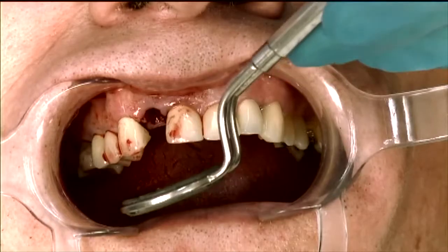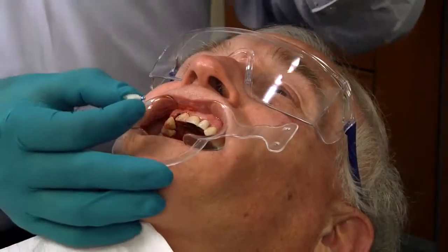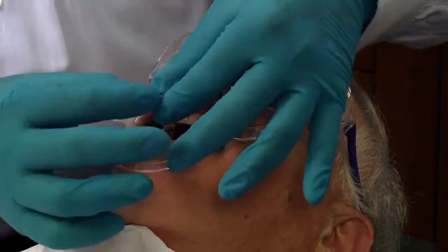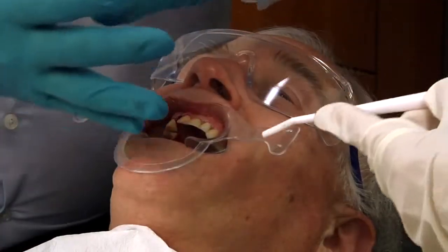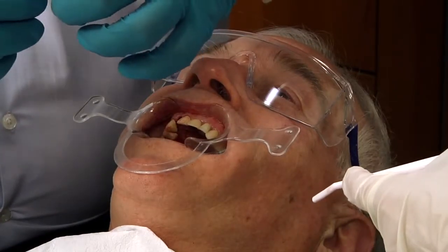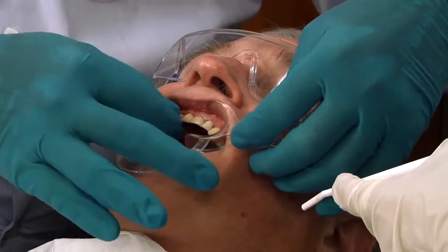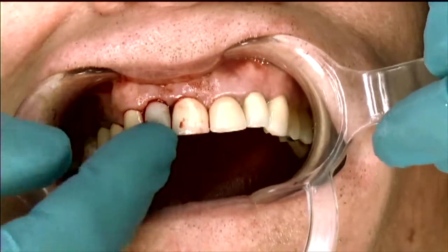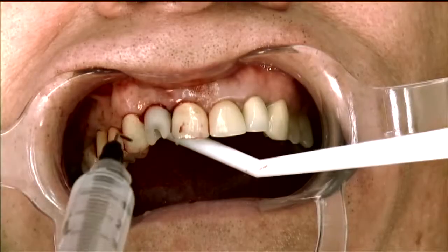So now we have our implant in the theoretically exact position that we planned on it being. Here is our pre-made implant temporary that I had showed you guys earlier — how we made it with our screw access hole. So technically, this should just pop right in. And there we go — it popped right in. Our implant temporary pre-made fit perfectly. Everything's a great design.